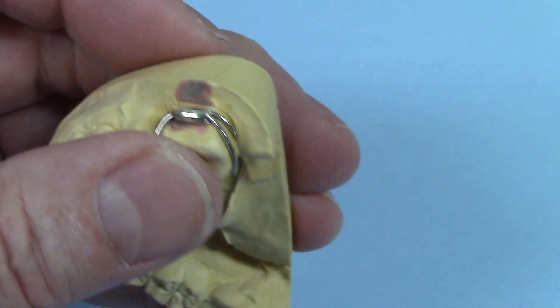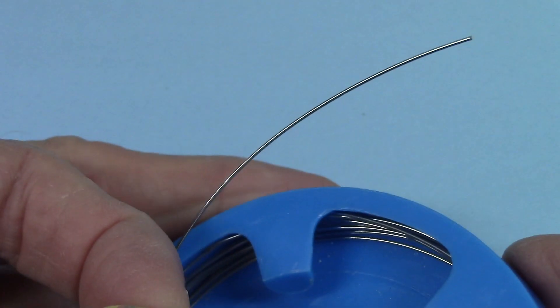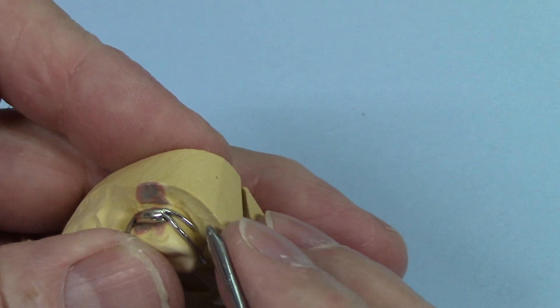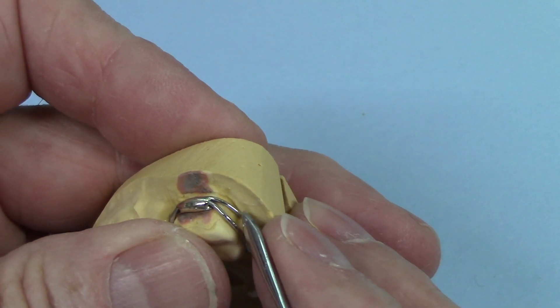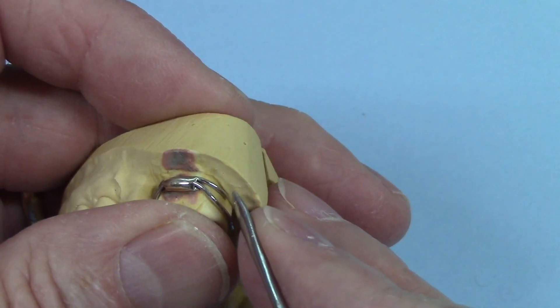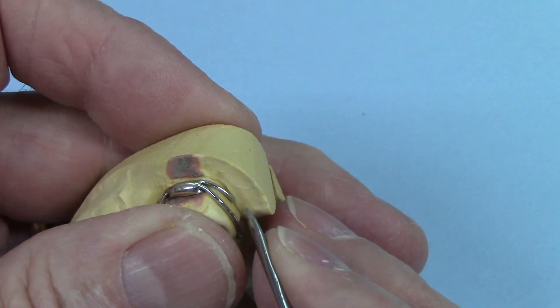The wire I use is an .028. It's called Crozat wire. It's a cobalt alloy wire, and it works really well for this appliance or this clasp. It has a high tensile strength, which is needed because this clasp gets a lot of abuse, so it needs to be a strong wire.